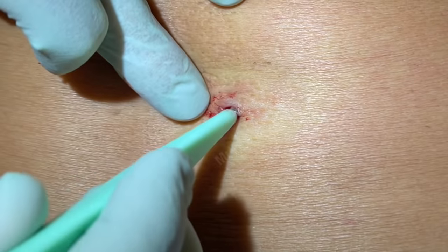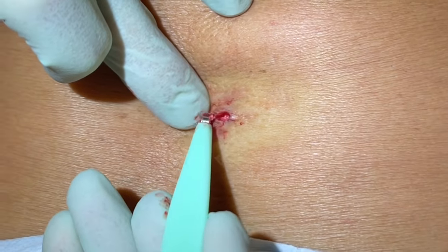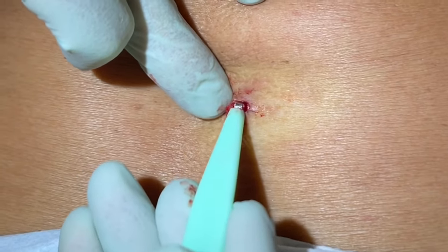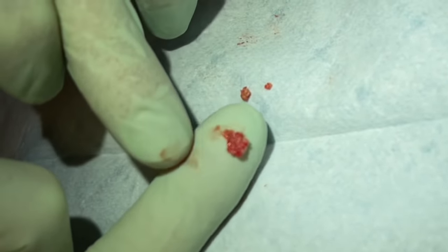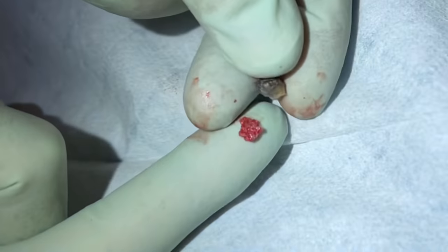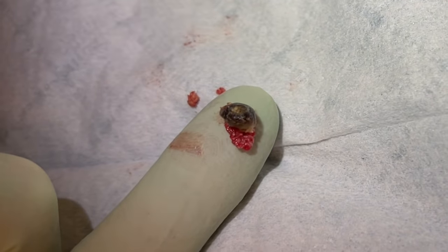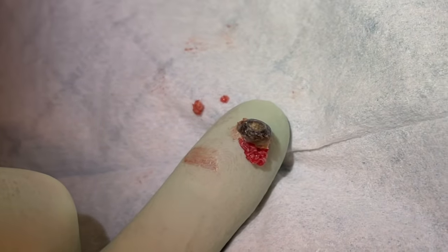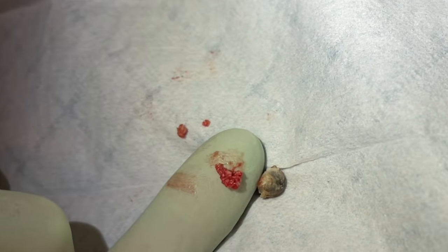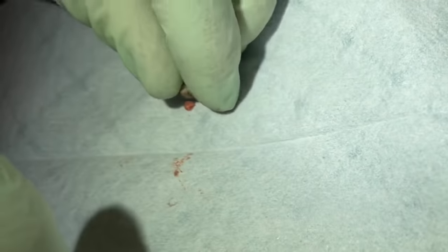Let me just get that — eight millimeter? We can do eight millimeter, with the 4-0. That way it'll close the hole for her so you don't have to worry about it. Here's the contents we got out of there — that's just cyst particles that were below that little nugget. That's just a dried out cyst that was too close to the surface. Dead skin would eventually refill it, so I can just punch that and close that hole and get the bottom of where that sack was out so it doesn't come back.